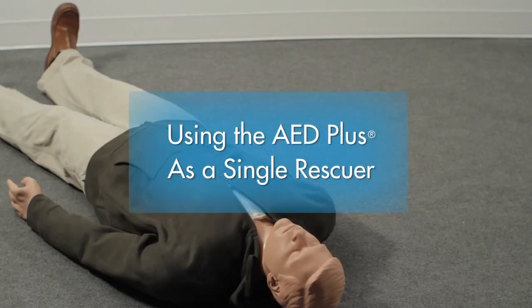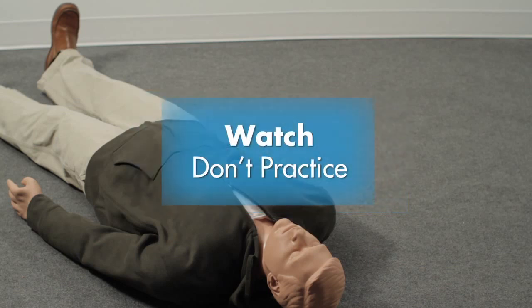Using the AED Plus as a single rescuer — watch, don't practice the following demonstration.